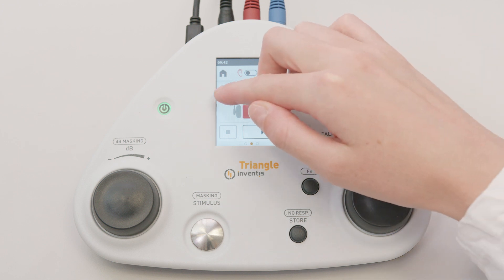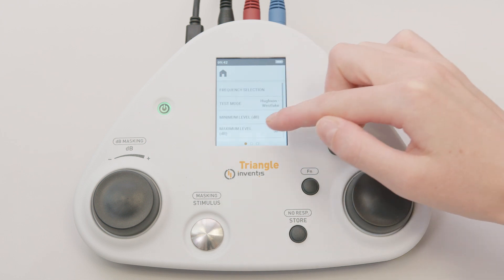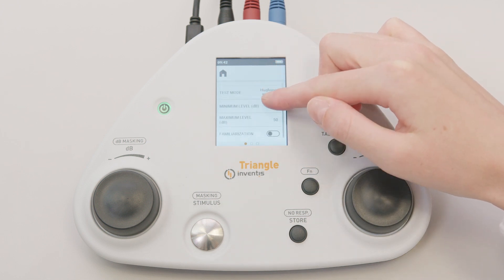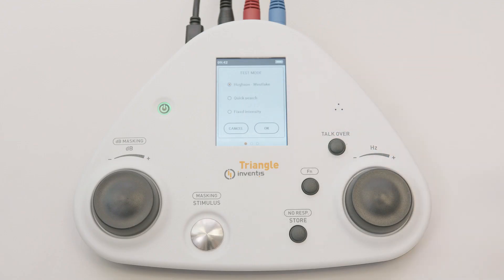Sliding your finger to the right on the screen brings up the settings menu, from which you can change many options such as frequency selection and minimum and maximum level that can be reached in the test. From this menu, the test execution mode can be selected from three different modes.